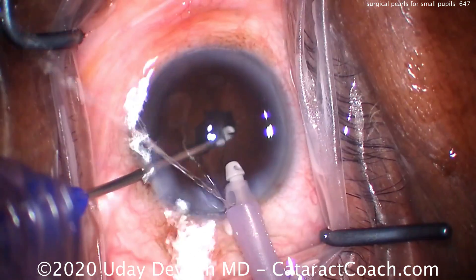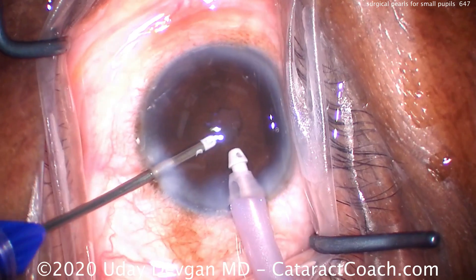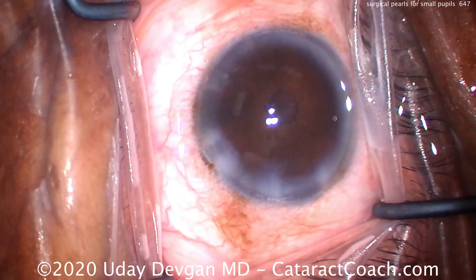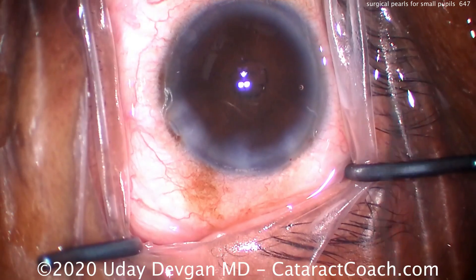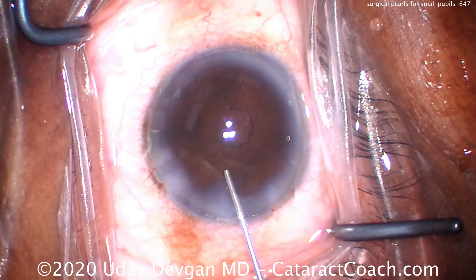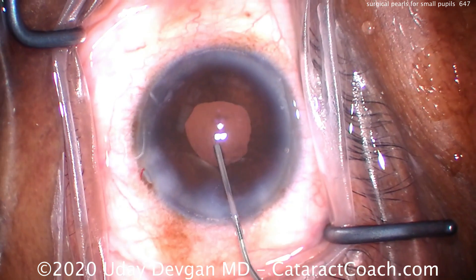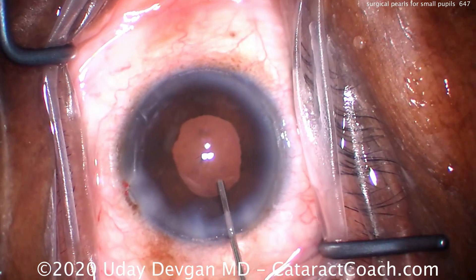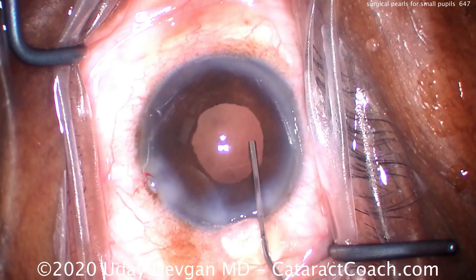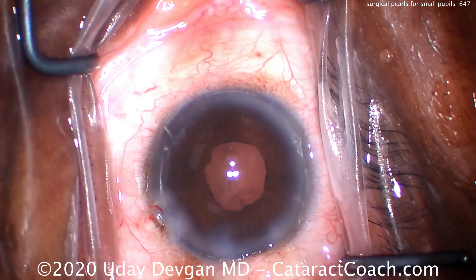Now getting back here, here's the end of the case. Look how tiny the pupil has become — that's a very small pupil now. We've removed all the cortex, but what are we going to do next? Let's fill up the eye with more viscoelastic. There's this cohesive viscoelastic — it expands the pupil a little bit, and that's helpful. What we'll do now is implant the IOL. We're going to put a single-piece acrylic lens in the capsular bag.